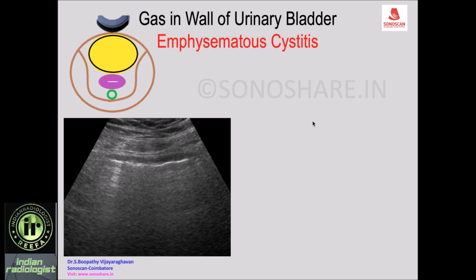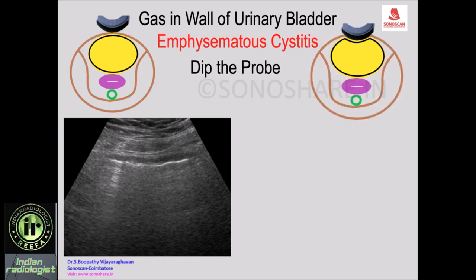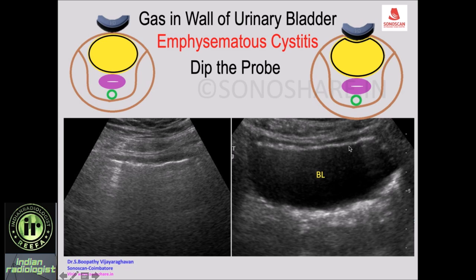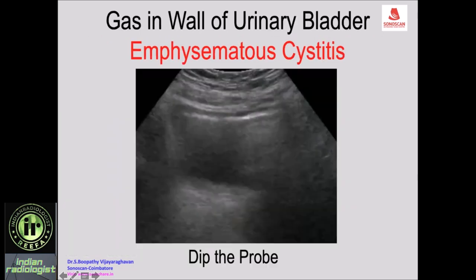If the gas is in the wall of the urinary bladder — emphysematous cystitis — there will be gas within the wall, and some will also escape into the lumen. When you dip the probe, the luminal gas gets displaced, but the gas within the wall remains the same. You see the wall and in the wall you see the echogenic line, confirming that the gas is in the wall, not just the lumen.